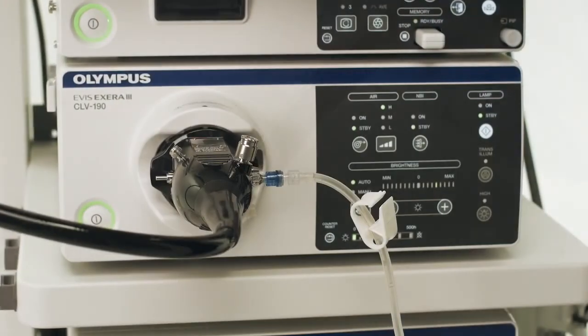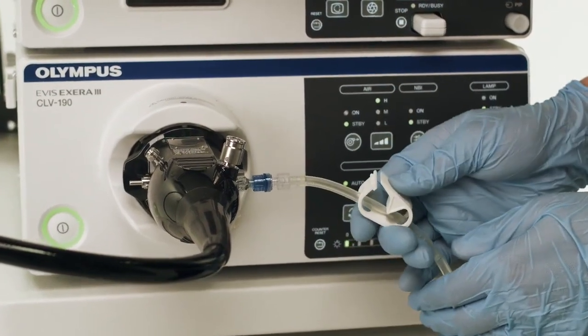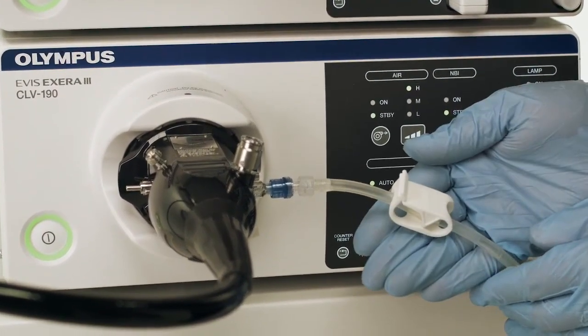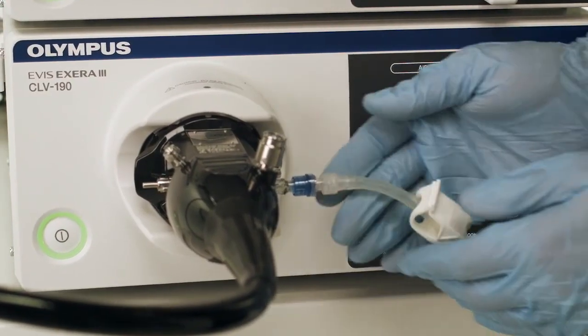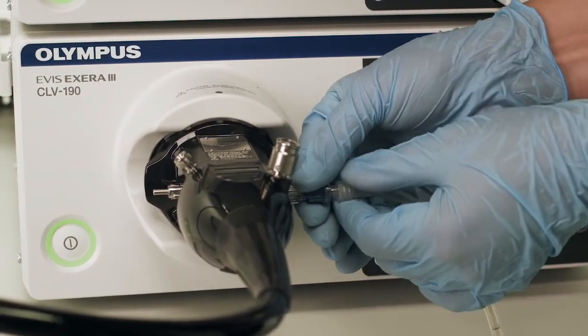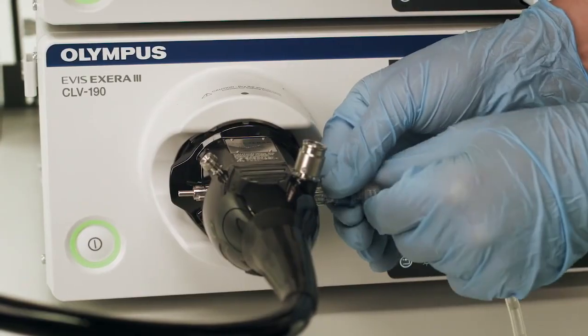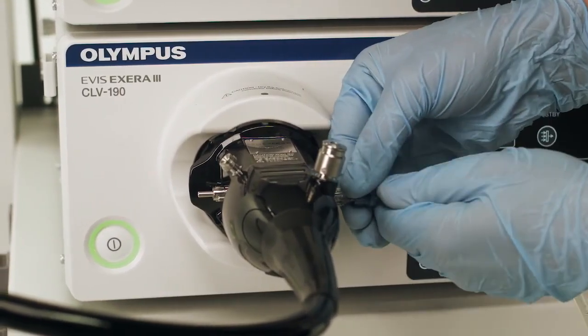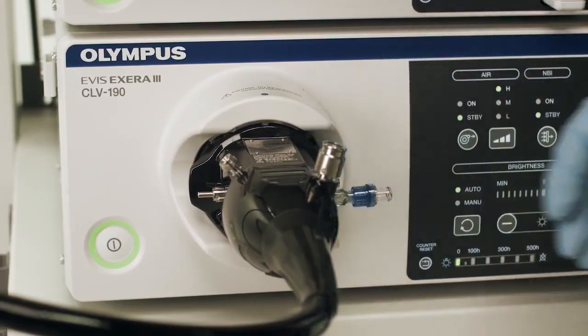Upon completion of the procedure, engage the pinch clamp by pressing between the thumb and forefinger, ensuring that the clamp compresses the tube. Then detach the tube set from the adapter by holding the MAJ 1652 in place and rotating the lure fitting, leaving the adapter on the endoscope.